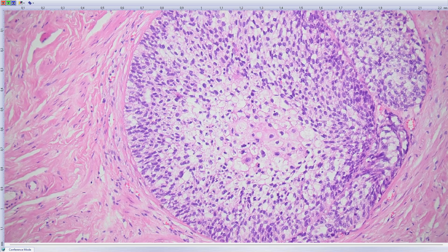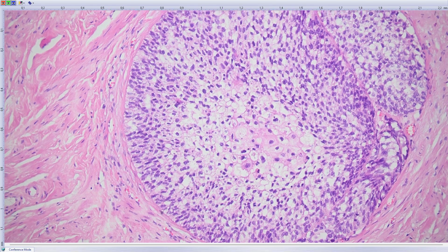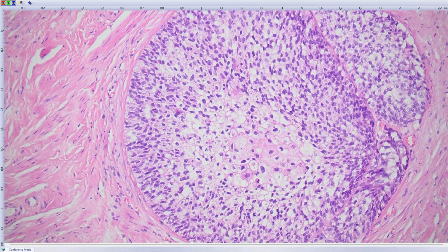And although my colleague who showed me the polyp wasn't very sure whether this couldn't be some metastatic squamous cell carcinoma, I believe it's not. It's squamous metaplasia in adenomatous polyp. This is not a very frequent lesion. I never saw any.